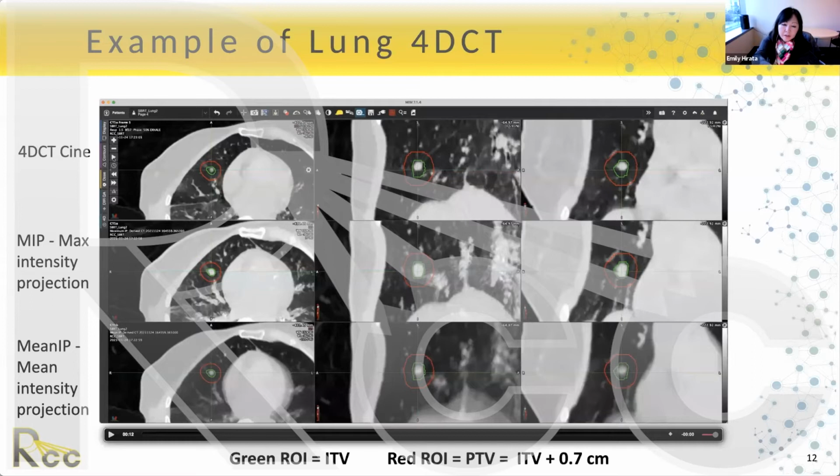If you imagine you've got 10 pieces of paper, where each piece of paper represents a phase, a stack of 10 papers, or transparencies actually is a common example. And you were to take a ray, a pencil beam X-ray, through a particular coordinate all the way through, and look at all of the intensities you would hit.